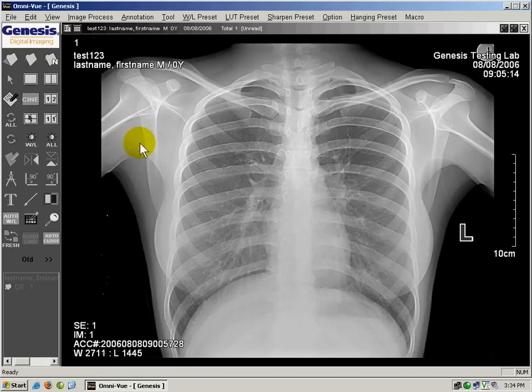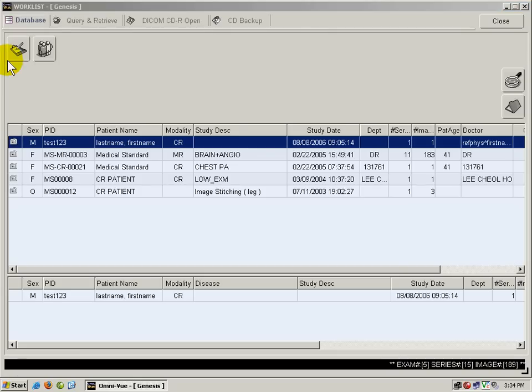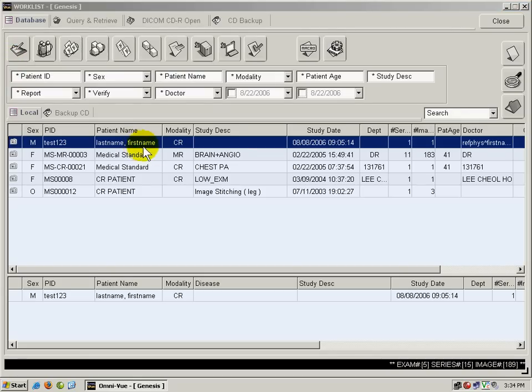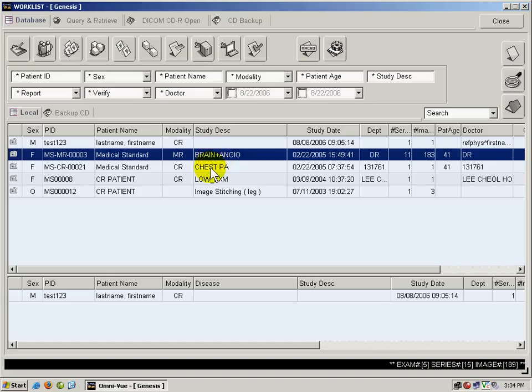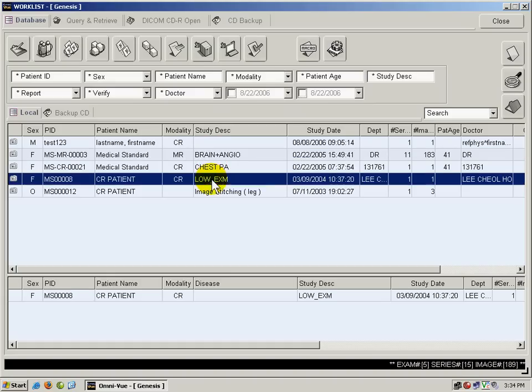The image will show up on the screen. To close the exam, we click the close button and open the work list. You can also select an exam and click the open exam button to open it.